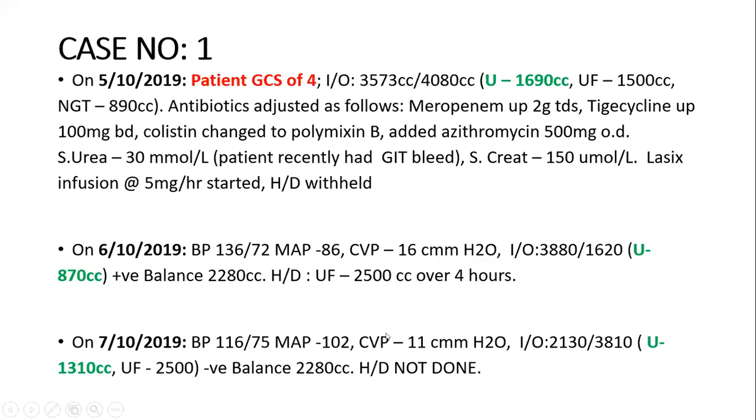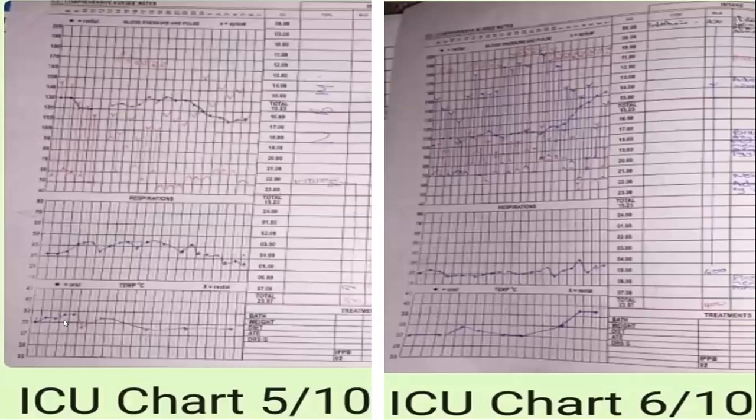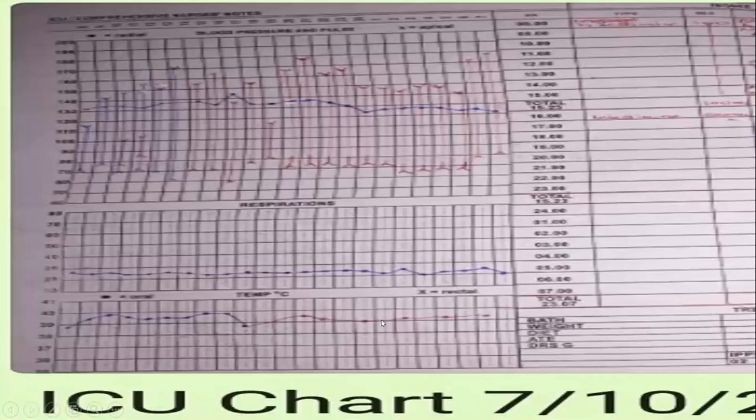We tried again to use hemoperfusion, but because of the cost factor, we weren't able to use it again. You see the effect of the hemoperfusion was maintained on the 5th, keeping the temperature below 38 degrees. Again, it was maintaining very well. But at 9 past midnight towards the 7th, you find that the temperature started going up again, and continued staying up despite trying different antibiotics.